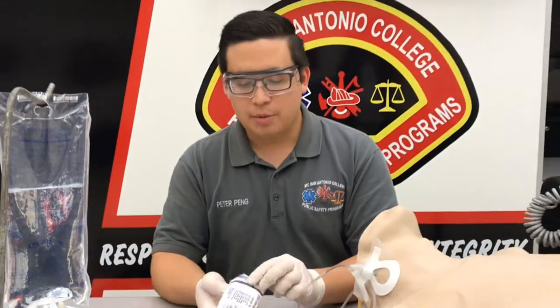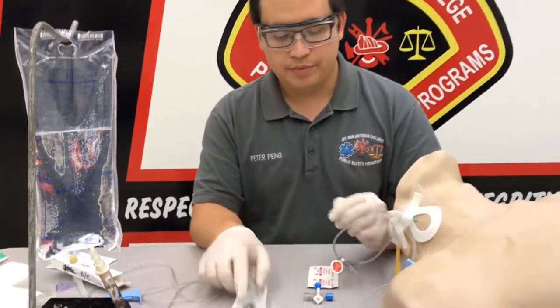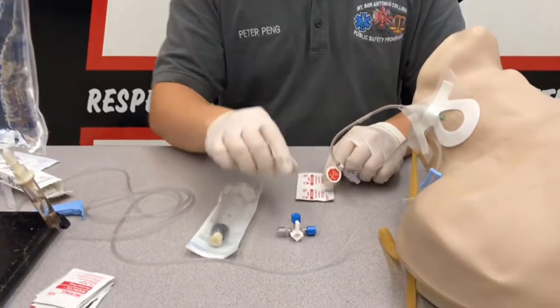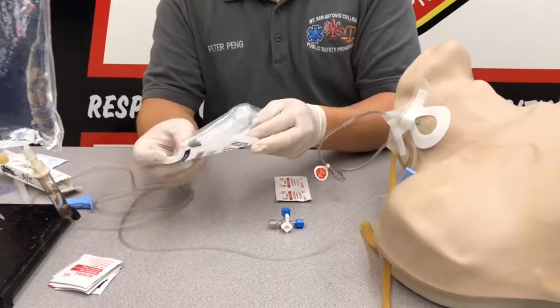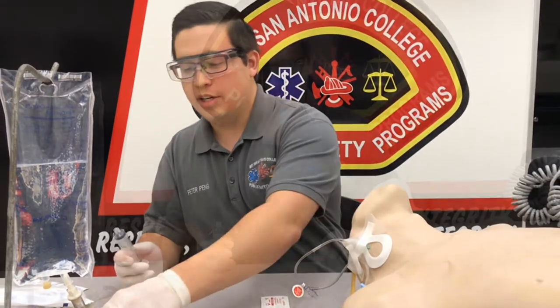Next, we need a couple of pieces of equipment: a 20 mL syringe, as well as a three-way stopcock, and some alcohol preps. With your 20 mL syringe, you need to draw up the full syringe of just normal saline.